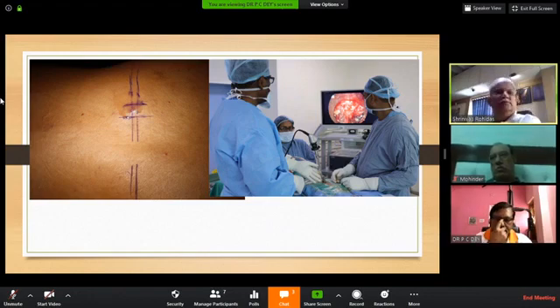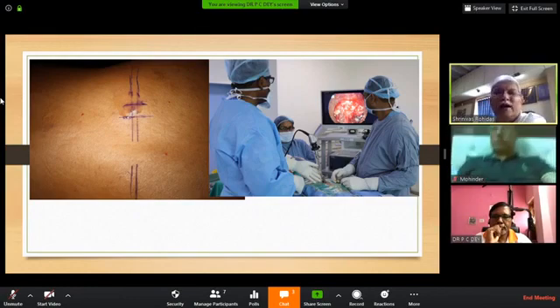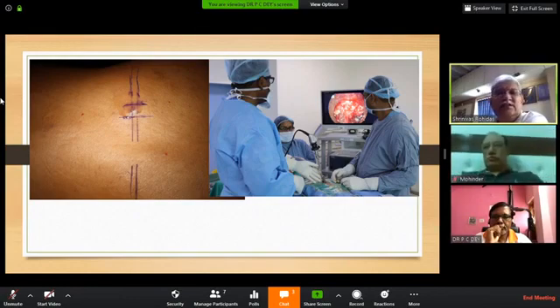If you are able to localize it nicely, if you follow the direction correctly, and if you know the anatomy of the bone after putting your outer tube, what you are going to see, then there are very few chances that you will get a wrong level.